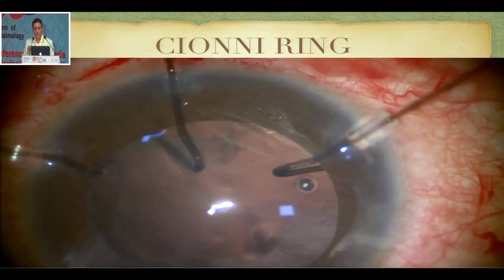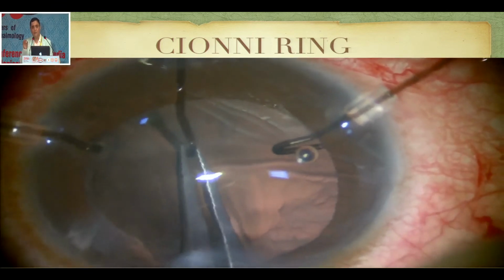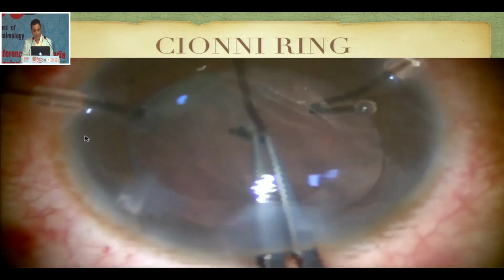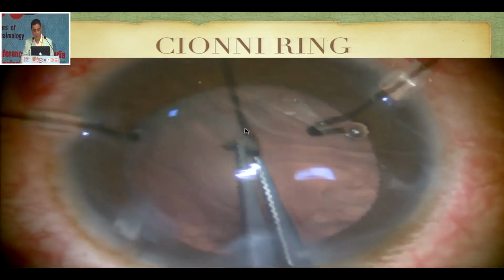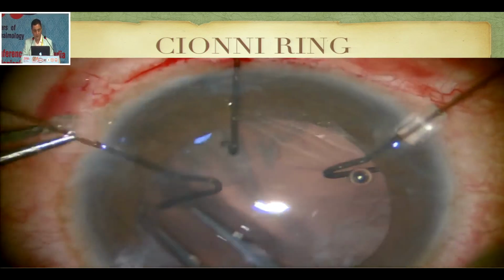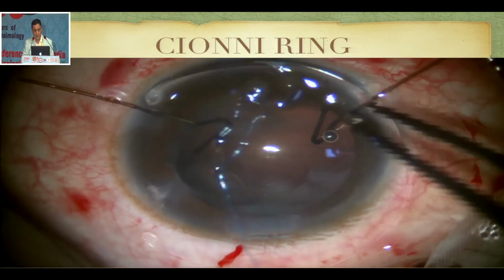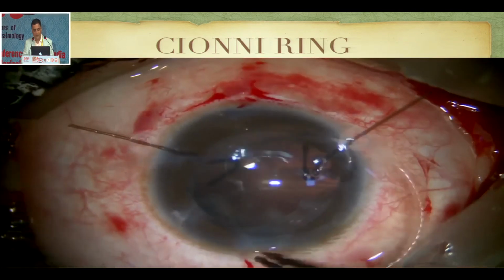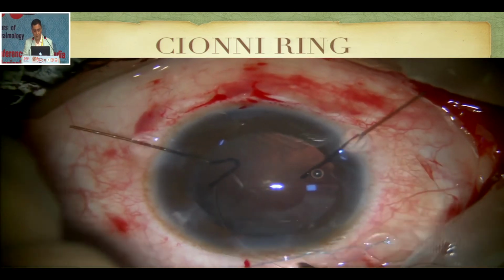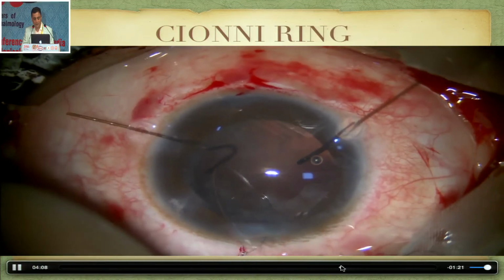Now I have to loosen the capsular hook because I'm going to put the CIONNI ring, because my inferior subluxation needs complete support. So I've loosened it a bit, then take your CIONNI ring. Once you've taken it, dial it into the bag and make sure that the hook comes anterior to the anterior capsule, anterior to the CCC. So now I'm dialing the CIONNI into place.